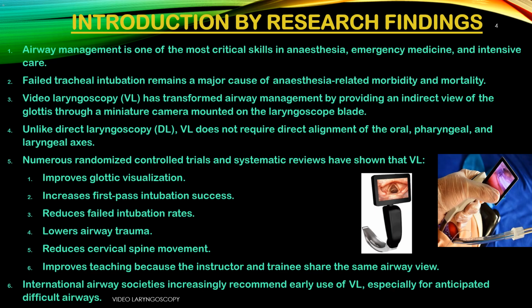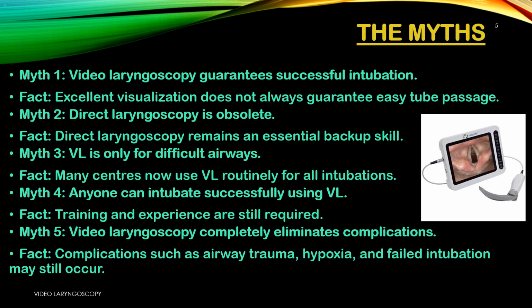6. International airway societies increasingly recommend early use of VL, especially for anticipated difficult airways. The evidence is clear. Use it early. Use it well.